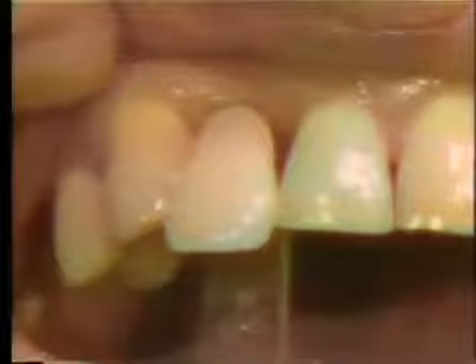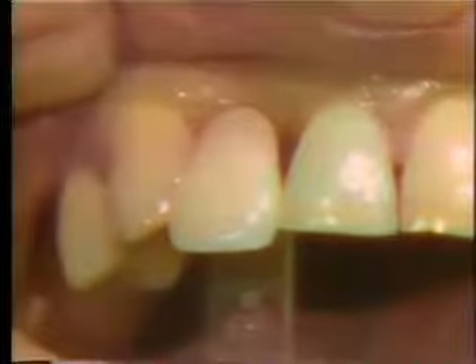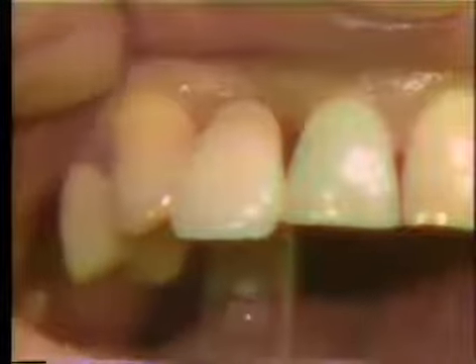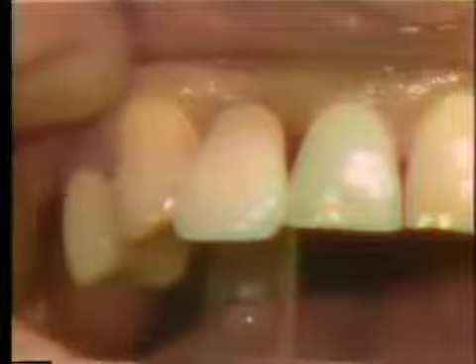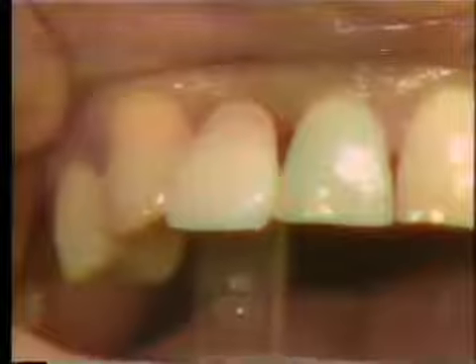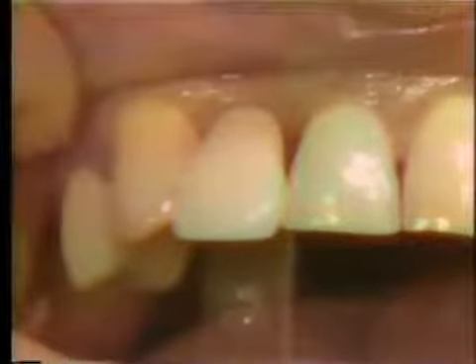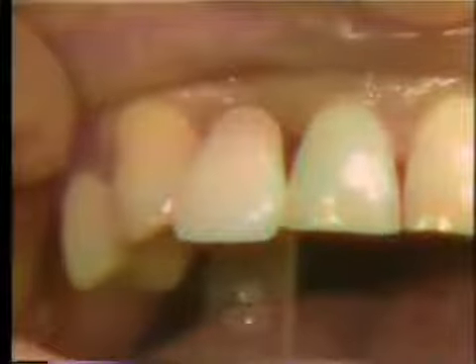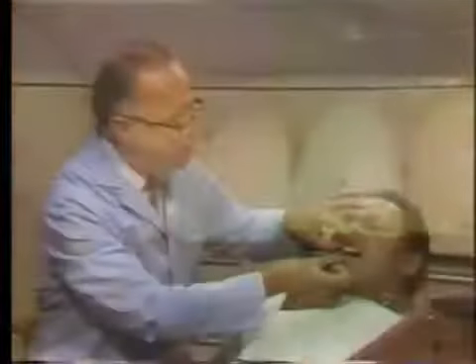One has to remember that it may or can be darkened up a little in the cementation process when the Pontic facing is fixed onto the backing. So we allow for that a little bit in the selection of shade at this time. And this shade 66 should be quite a good selection for this particular patient.